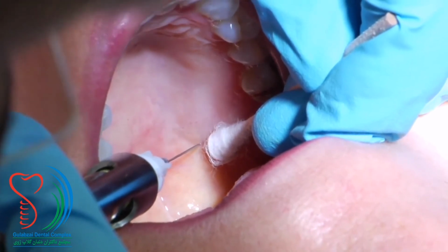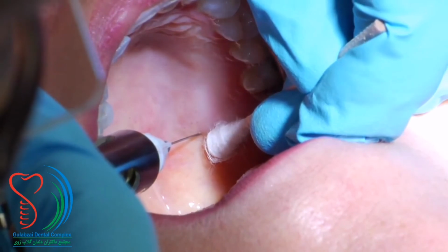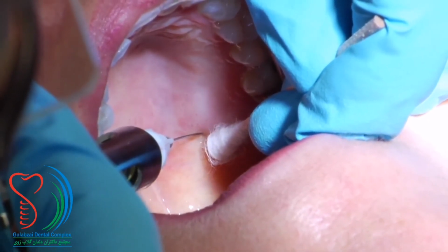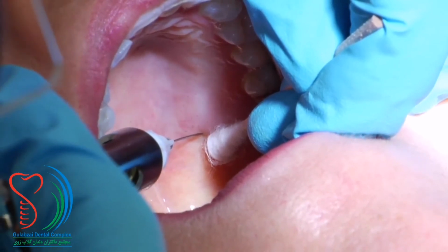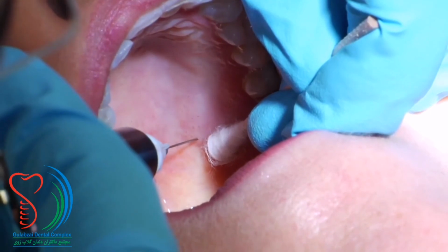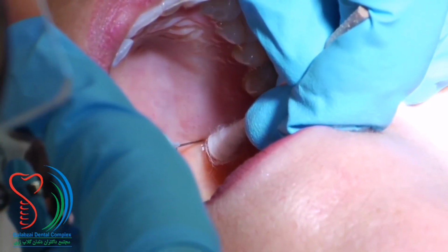As that takes effect, slowly let the needle penetrate into the tissue. This is a shallow injection, and with the 1/4 inch depth, you will meet resistance quickly. After a negative aspiration, very slowly deposit approximately 1/4 of a carpule with multiple aspirations.